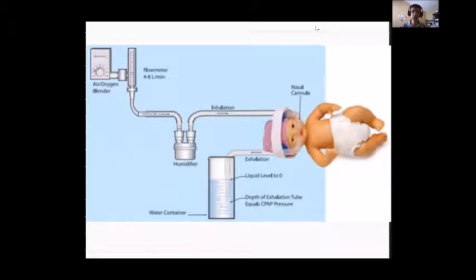But if you're talking about, yeah, I'm trying to explain. No matter how many centimeters of water you have, you can fill the water in here, you can keep it in here, but your measurement should start from the surface of the water. Whether it's in here or in here, it's how much you are dipping. So wherever your water is, if you are marking it yourself, no matter what.